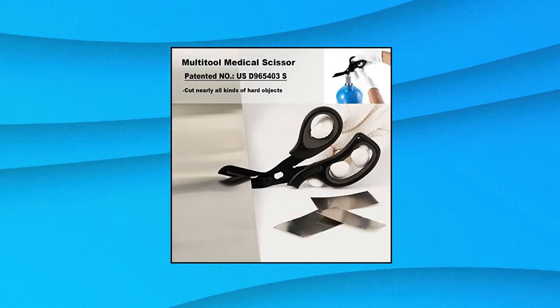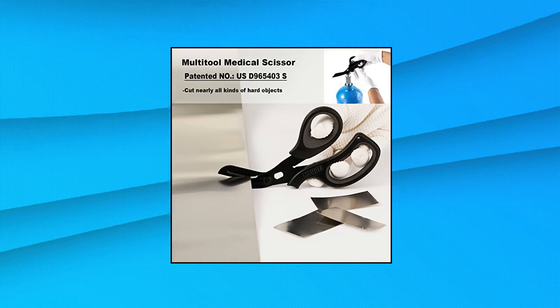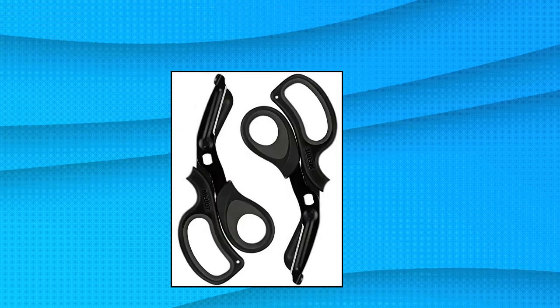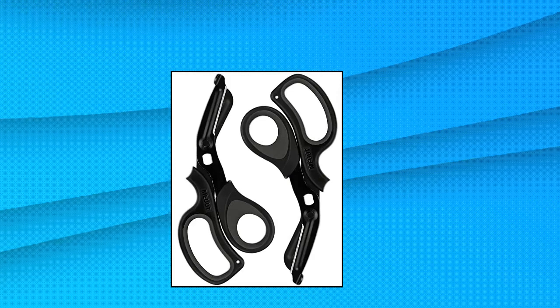Mute 2 Pack Medical Scissors Trauma Shears, 8 inches, patented bandage scissors. Patented medical scissors cut anything safely and efficiently with these sharp, professional grade medical scissors.